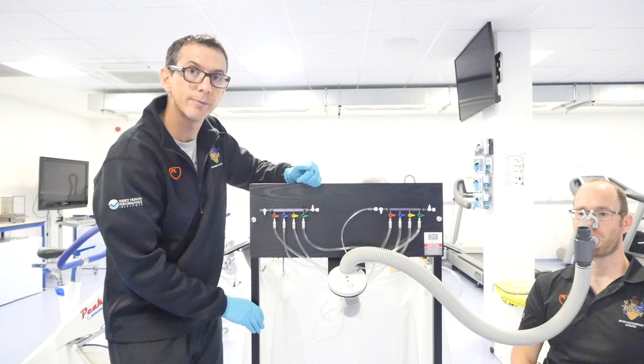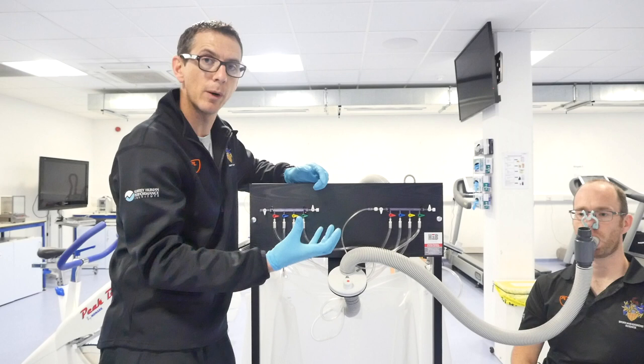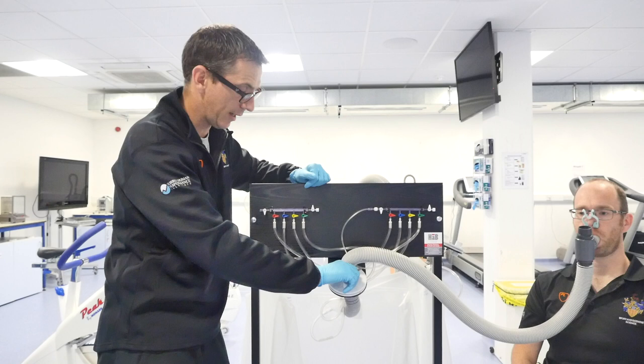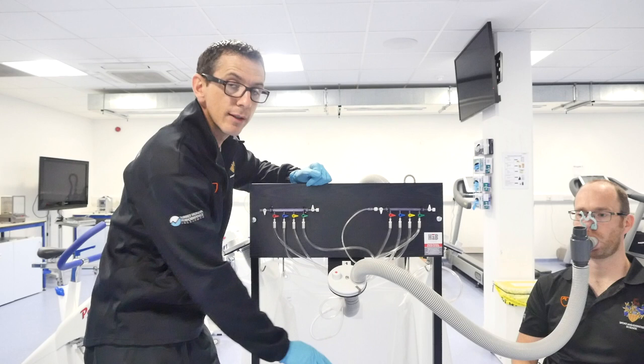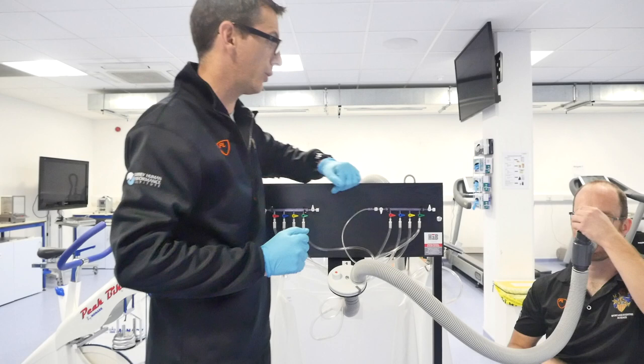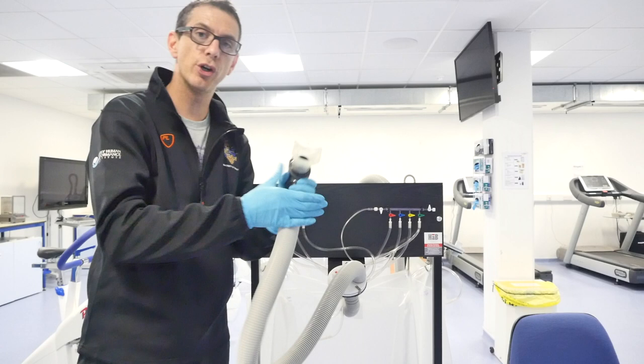Once we've collected for the desired time, I don't get the participant to remove the mouthpiece. What I do is open the disc so the participant is just breathing gas into the atmosphere, and I've sealed the Douglas bag itself. Now I can take the mouthpiece off and disconnect from the Douglas bags. Make sure you still wear your gloves to keep yourself protected throughout. And that's it.